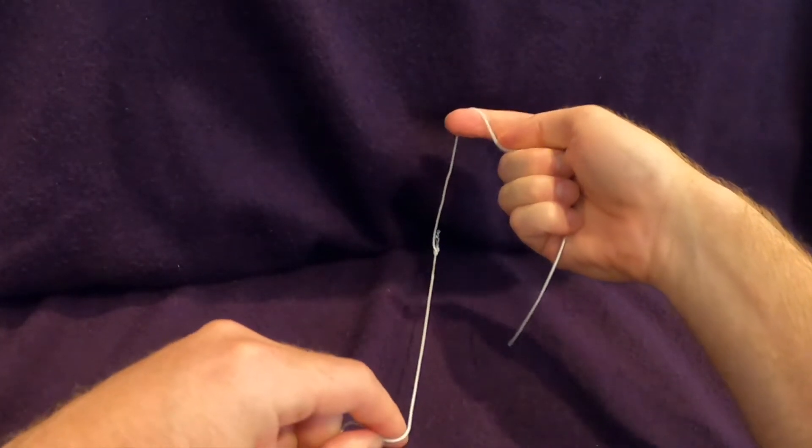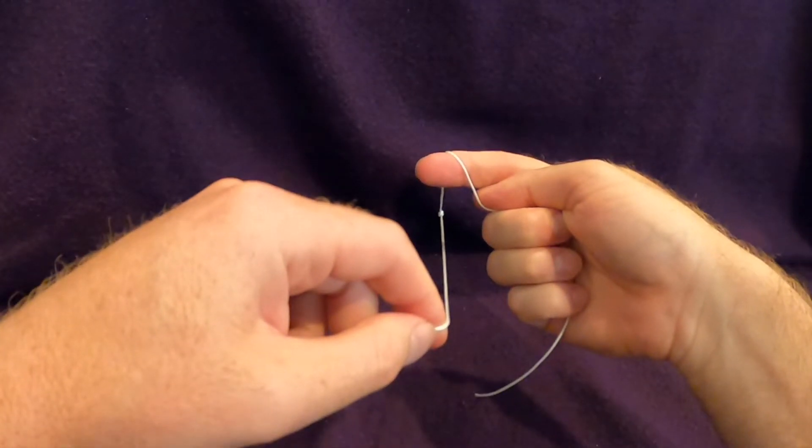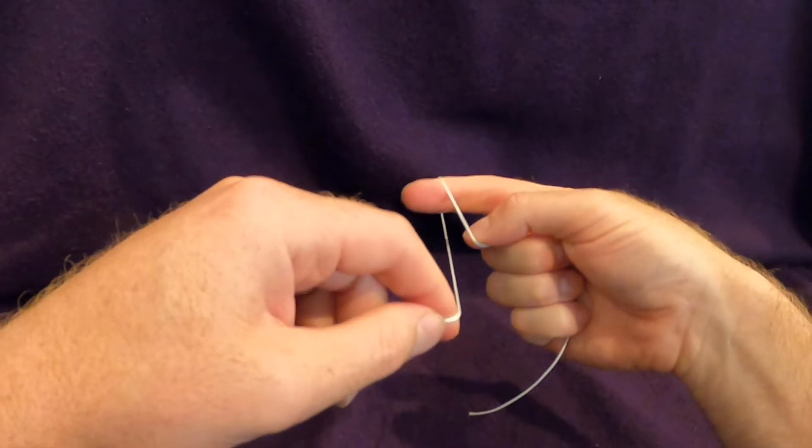The knot is tightened and the next throw begins by draping the suture across the index finger with the tail pointing towards the person tying the knot.